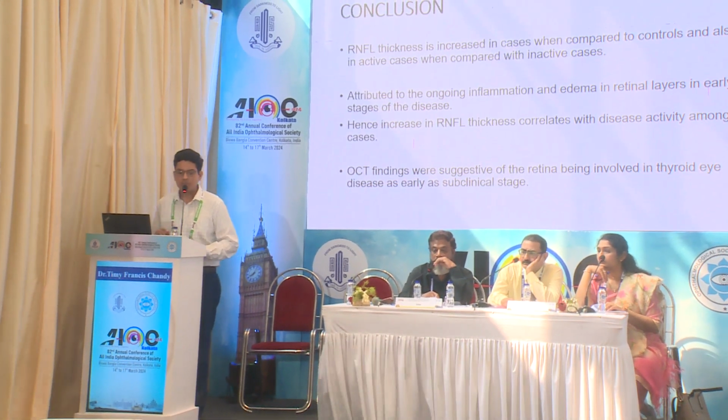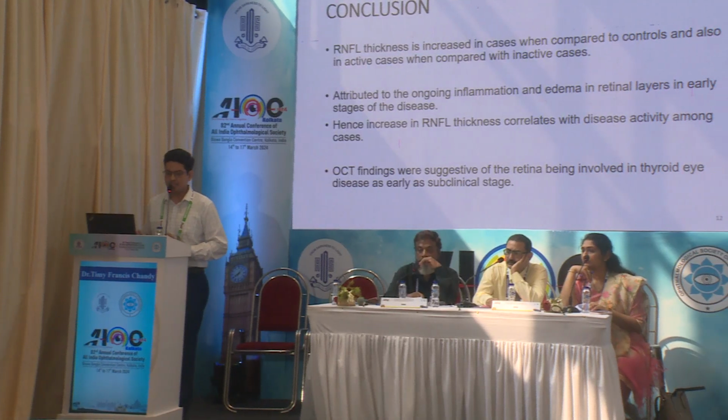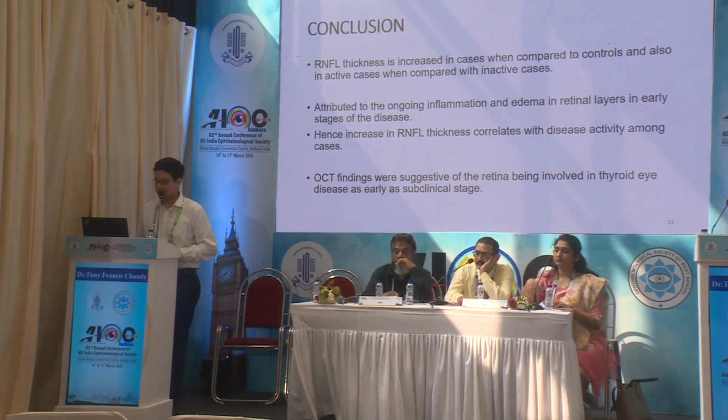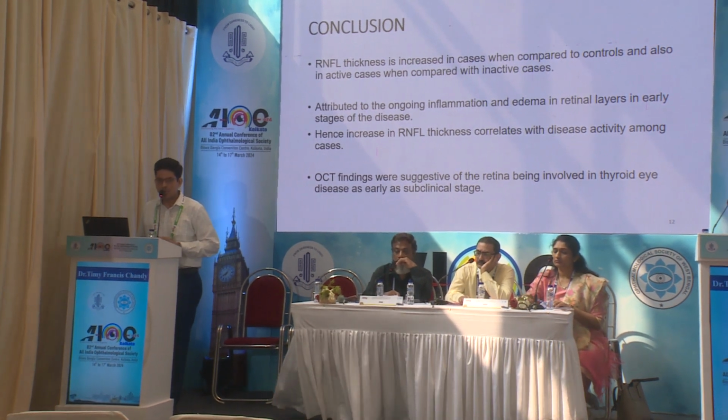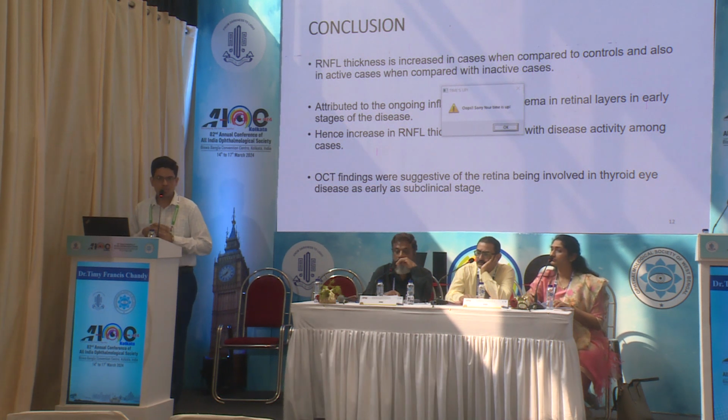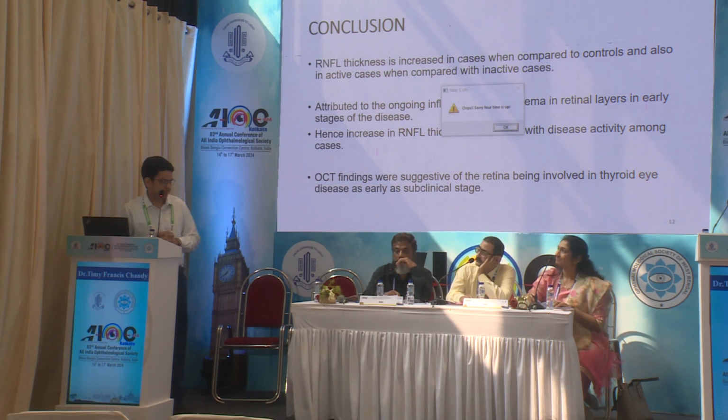To conclude, the RNFL thickness is increased in cases when compared to controls, and also in active cases when compared to inactive cases. This was attributed to the ongoing inflammation in retinal fiber layers in early stages of disease, and this can be used to pick up cases early.